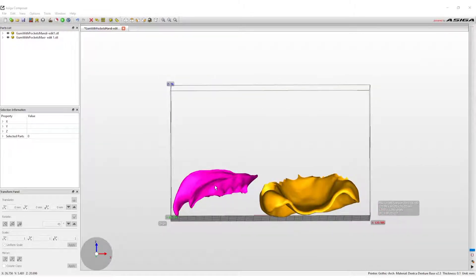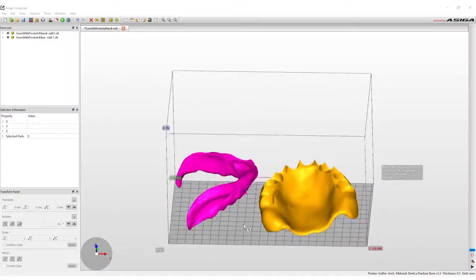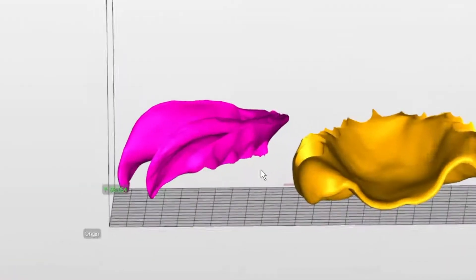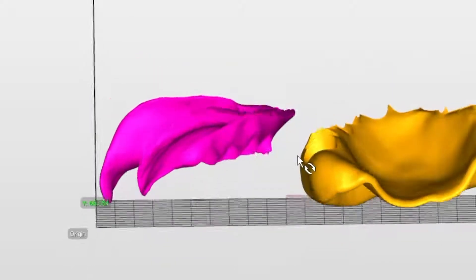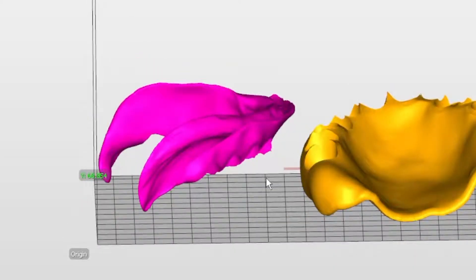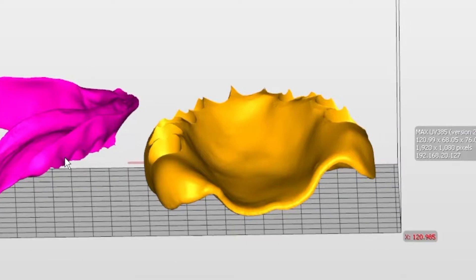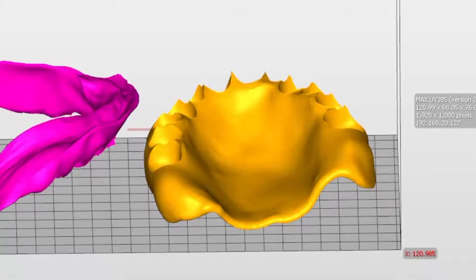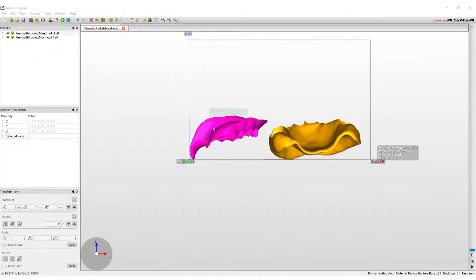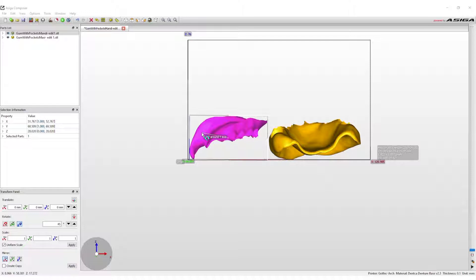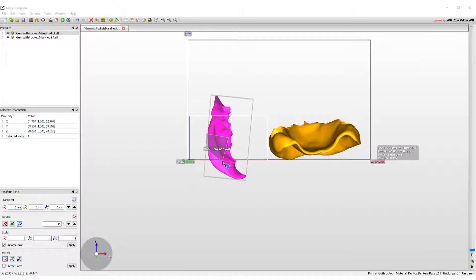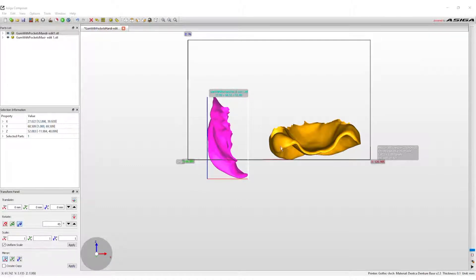The files will appear in their default positions in the build envelope, which is horizontal along the bottom plane. The bases print best in the vertical position because it reduces the number of supports necessary on the denture. If the design on the screen appears in pink, that means some aspect of the design is outside of the print envelope. If the design on screen is gold, that means the design is within the print envelope boundaries.